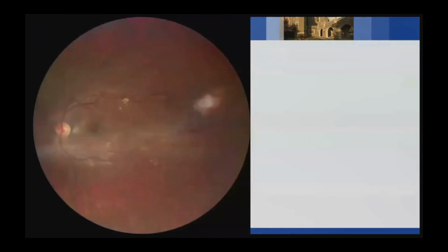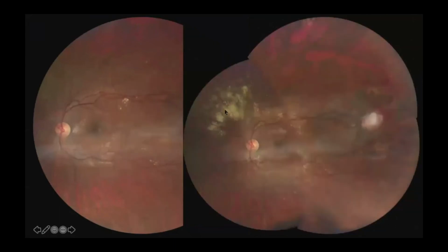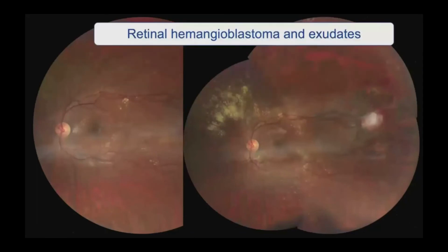Another patient. This is a patient who did not have von Hippel-Lindau disease, but he did have this retinal hemangioblastoma, solitary, with some exudation, some inflammation in the macular area. A few months later, he showed more exudation, received some treatment, some bleeding, and we're still seeing this patient. So this was a retinal hemangioblastoma with exudates.